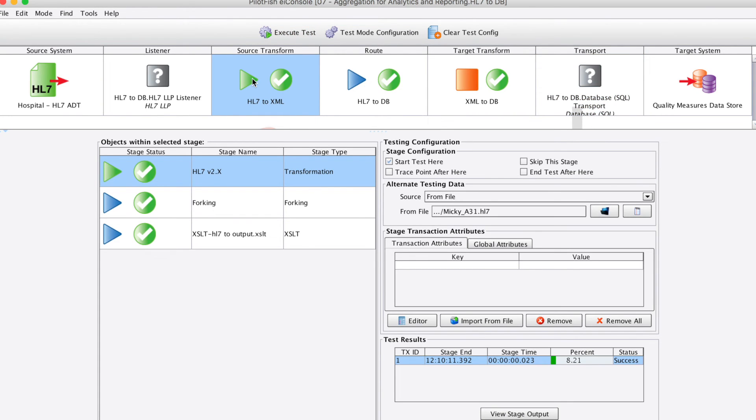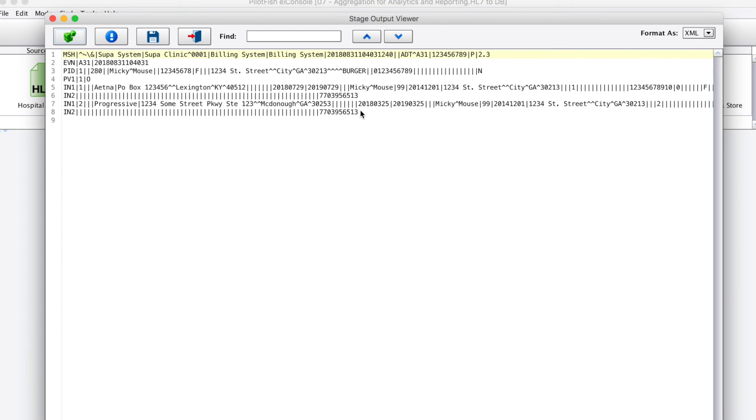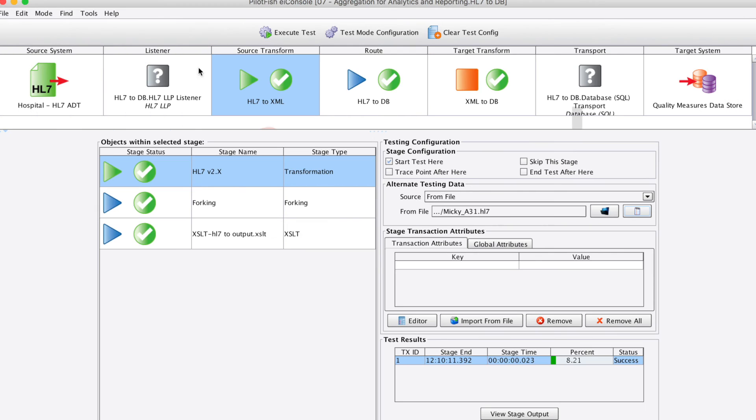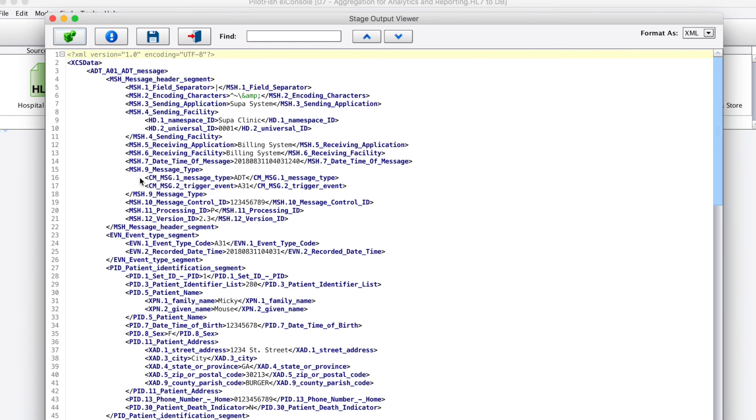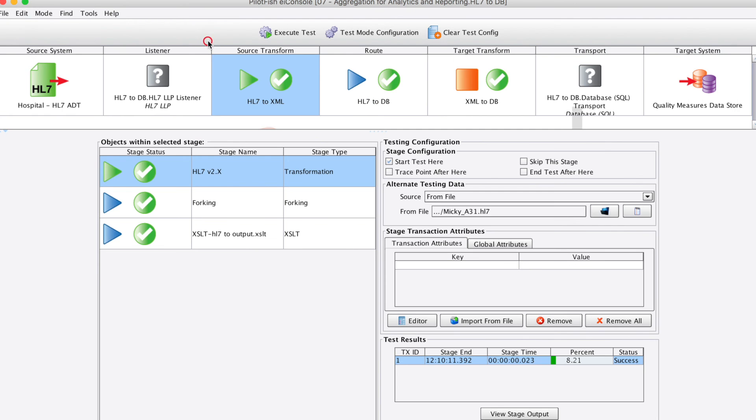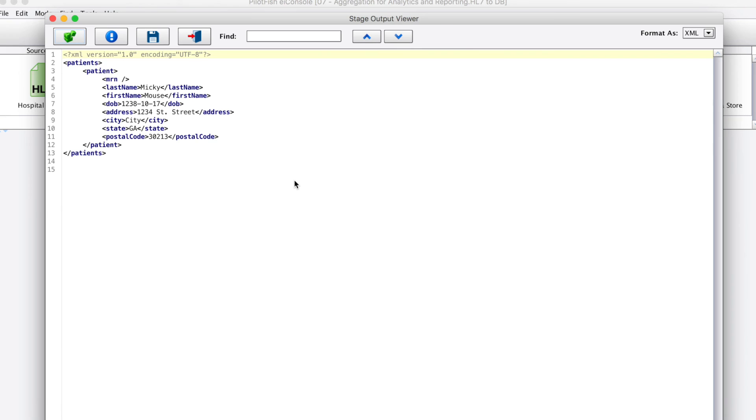Starting with the source transform of the test, we can see each stage output throughout all of testing modes. Here we can see the sample file of HL7 that was sent into our test. Here we can see an XML representation of that HL7 that was created. Here we can see the XML that we parsed just using those simplified patient data.